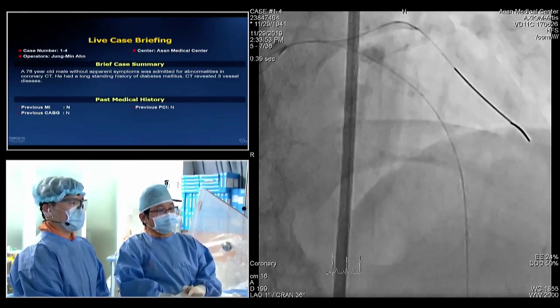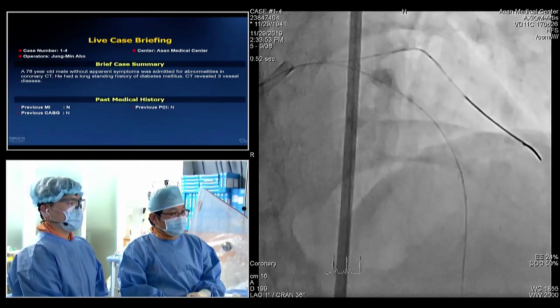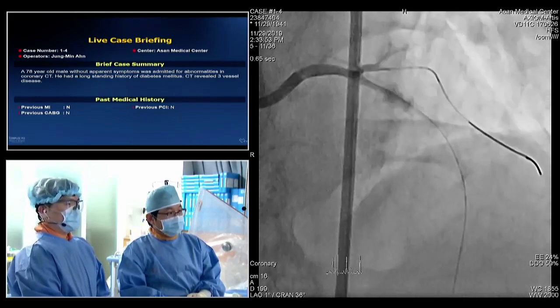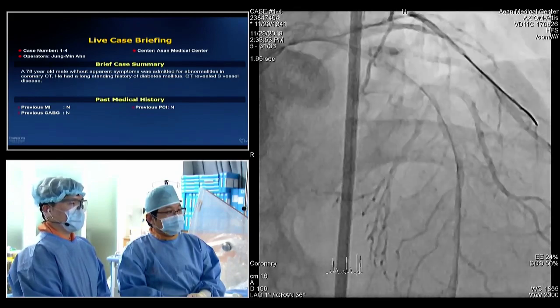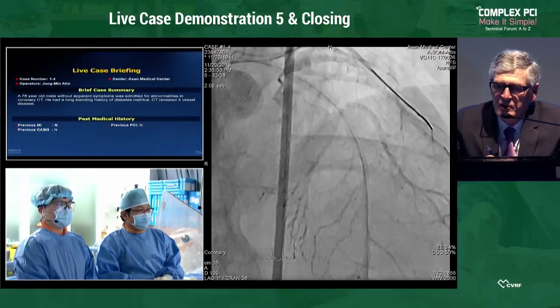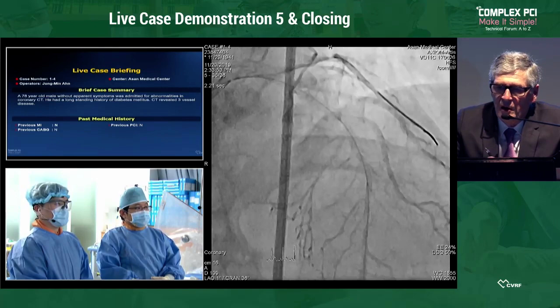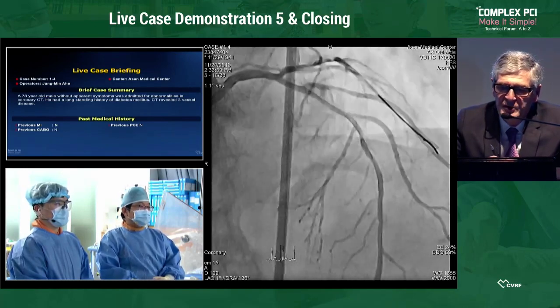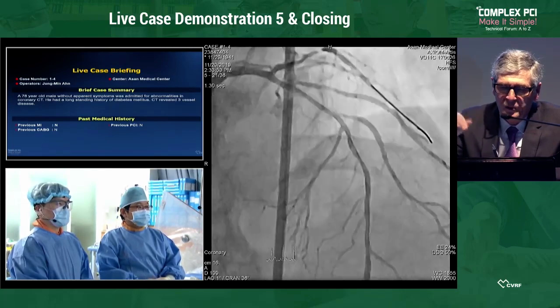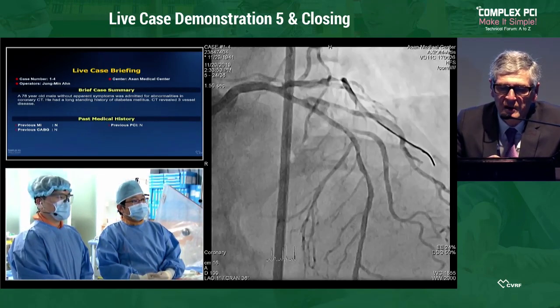Yeah, I agree with Antonio. Okay, thank you, Antonio. Dr. Ann, I think one of the questions is up to where you will put a stent, because the lesion is very long, up to this small diagonal branch that we see at the bottom of the screen. The second question is protection of the two diagonal branches, because it's purely an ostial lesion, especially the second one. I'm not sure that I will put a stent there, just protect it. And the last question is whether the left main is significant. When you did FFR, did you check all along the vessel for any drop of the pressure? Is the left main really significant by FFR, or is it only this long lesion of the LAD?